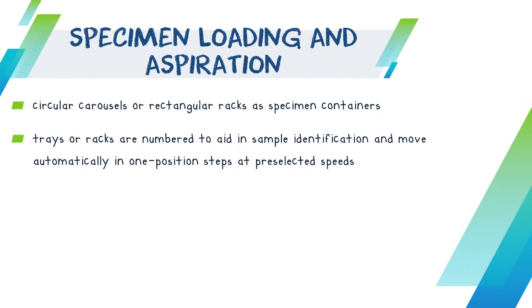Even in your trays, there are barcodes placed and mga numbered barcodes so that when you set or encode ang kaniinyong mga samples in the computer of that auto-analyzer, inyo siyang iset up inline sa kung unsa pud ang katong barcode sa inyong mga racks para na ay proper identification gihapon sa inyong mga specimens by the time na mo load na siya pasulod sa inyong machines.